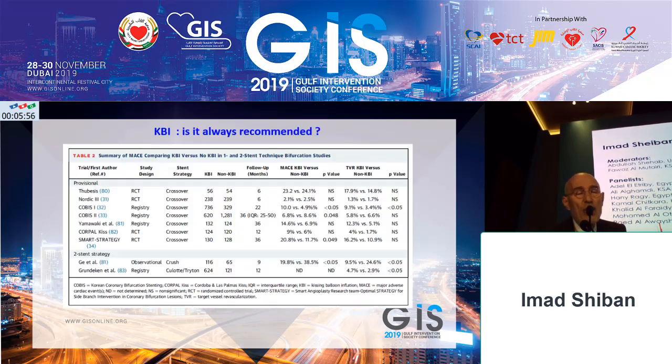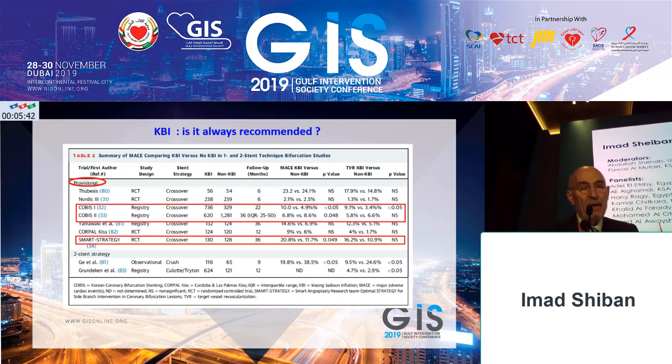And if we look at what is coming from the clinical trials, in daily practice and from studies, we can see that if we are dealing with provisional stenting, that means simple stent, then kissing balloon inflation is not affecting, and it might even be harmful, because patients with kissing balloon inflation are doing worse than without kissing balloon.